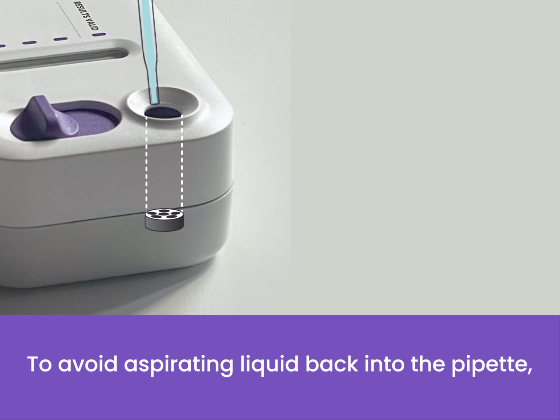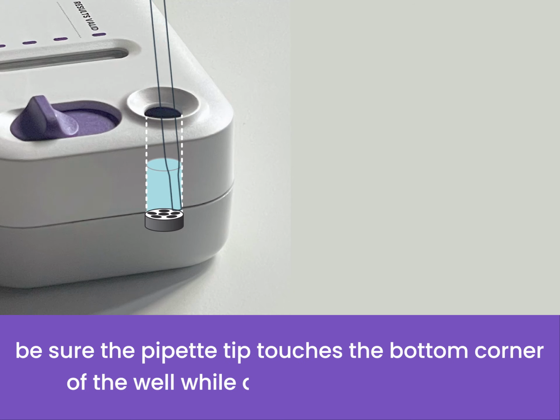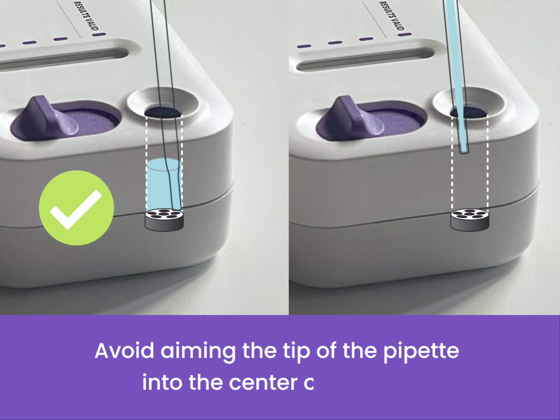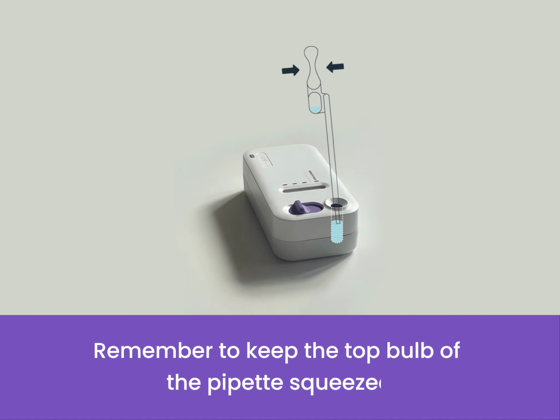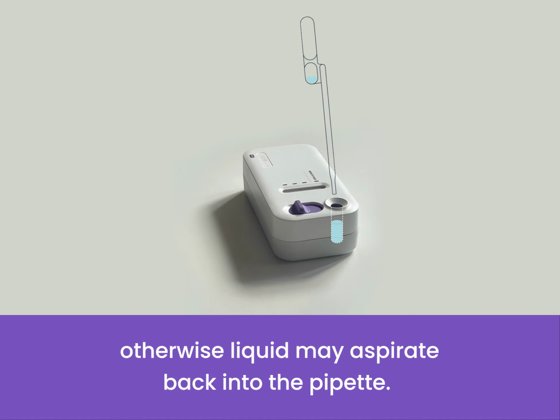To avoid aspirating liquid back into the pipette, be sure the pipette tip touches the bottom corner of the well while dispensing the sample. Avoid aiming the tip of the pipette into the center of the well. Remember to keep the top bulb of the pipette squeezed as you remove the tip out of the liquid line, otherwise liquid may aspirate back into the pipette.